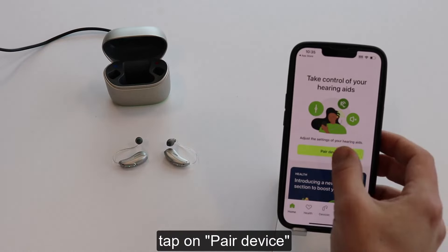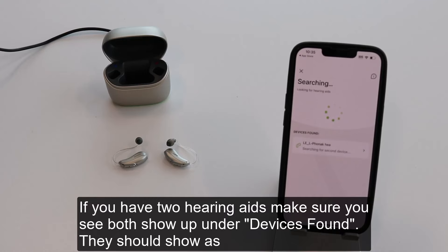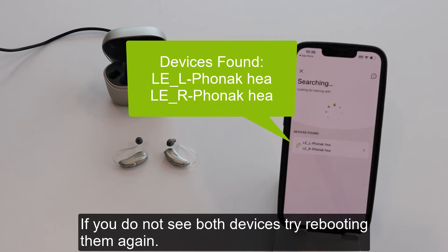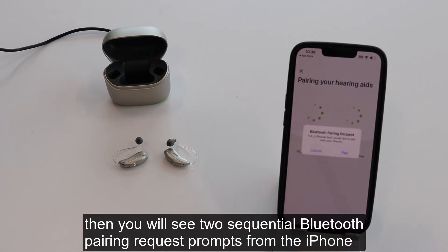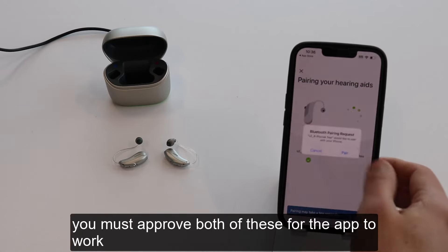Tap on pair device, then let's get started, and continue. If you have two hearing aids, make sure you see both show up under devices found — they should show as LE-R-PhonakHEA and LE-L-PhonakHEA. If you do not see both devices, try rebooting them again. Tap on them when ready. Then you will see two sequential Bluetooth pairing request prompts from the iPhone — you must approve both of these for the app to work.